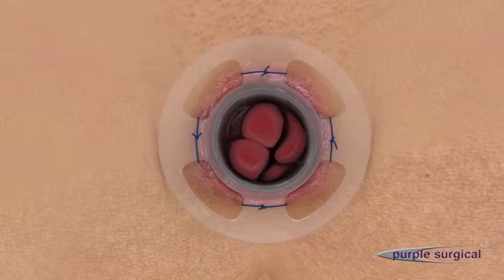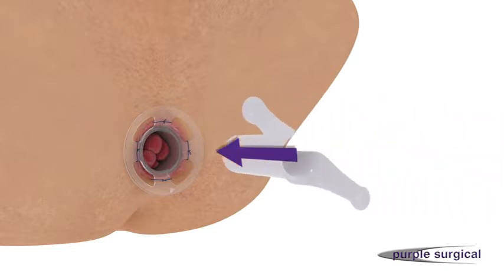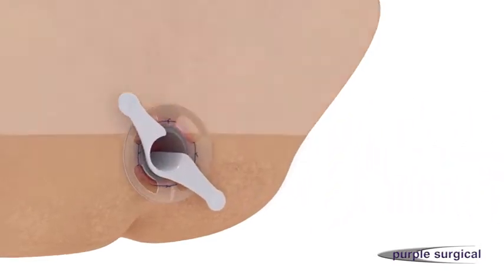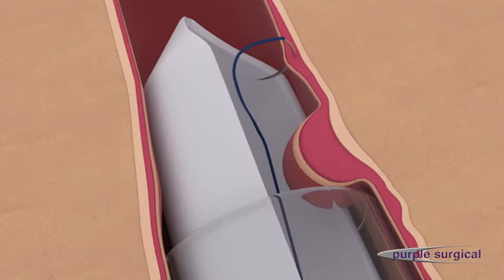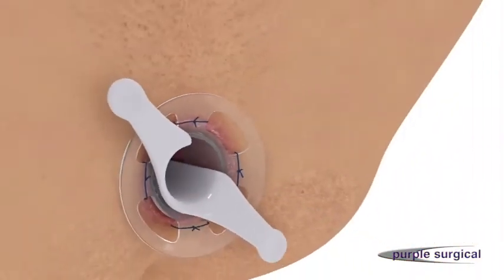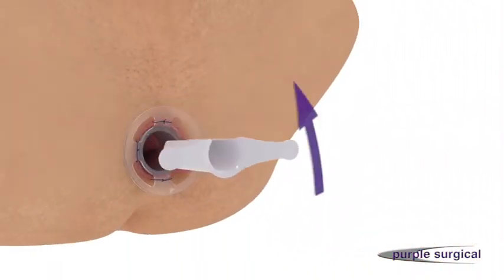Secure the clear anal dilator into place using the fixation sutures at the four cardinal points. Insert the purse string suture anoscope and rotate to complete a purse string suture around the entire anal circumference, only including the mucosa and submucosa that protrudes through the purse string suture anoscope window. After each suture, ensure the purse string suture anoscope is removed, rotated, and then reinserted.